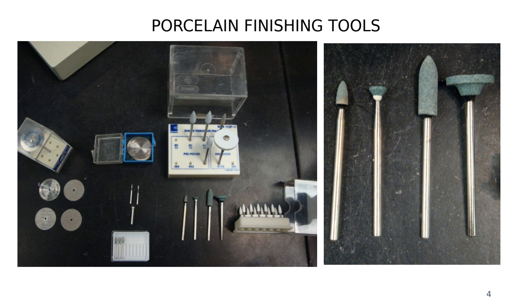Think about it this way. Some patients may have a very round, especially a female patient, on the centrals, they have a very round distal, right? So how do you do that? What kind of burr can you use to make it round but not sharp, right? Because if you take a burr and you start cutting, you make it round, but it's going to be sharp. So you have to roll the surface.